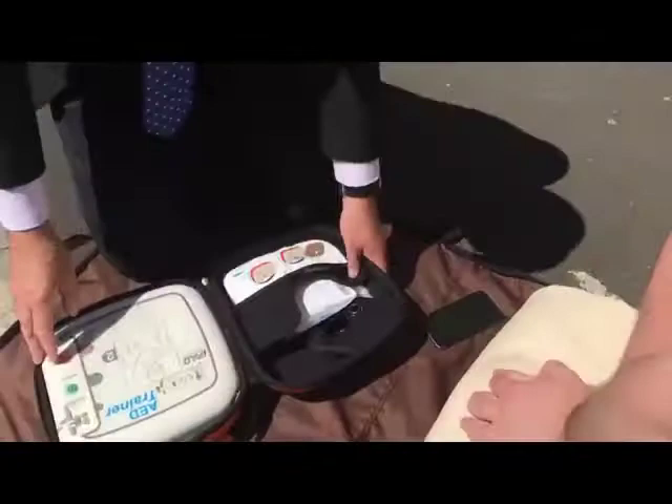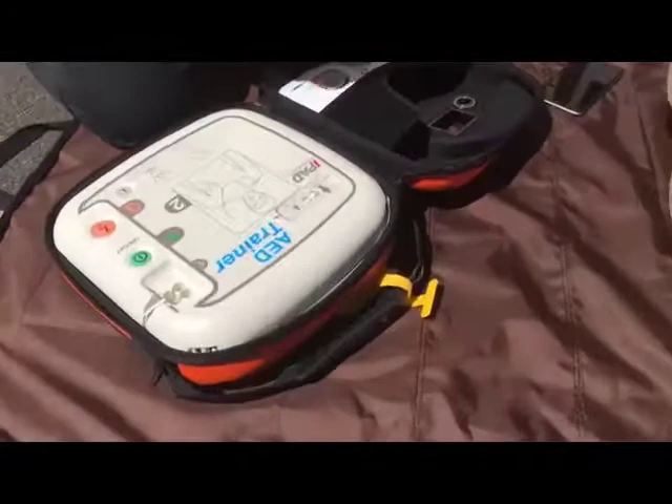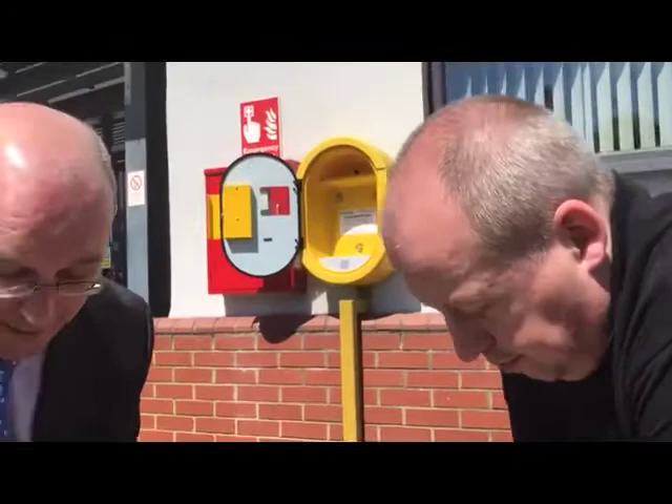I'm opening the defibrillator. They differ between brands, but they all have an on/off switch — here it says 'on', so you turn it on. It reminds you to call emergency medical services, which we've done — they're on the phone. It's now telling us to plug the pads into the device; some devices come with pads already in.